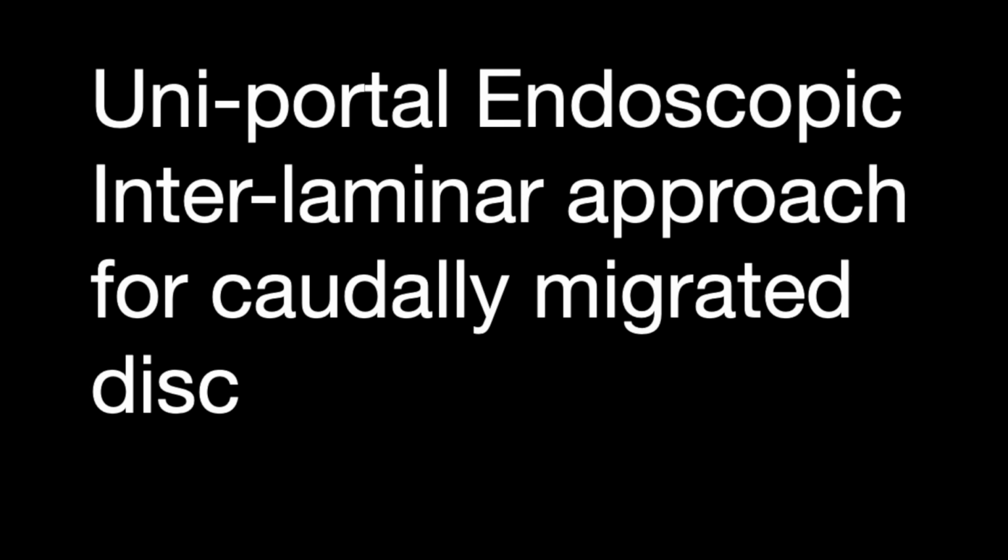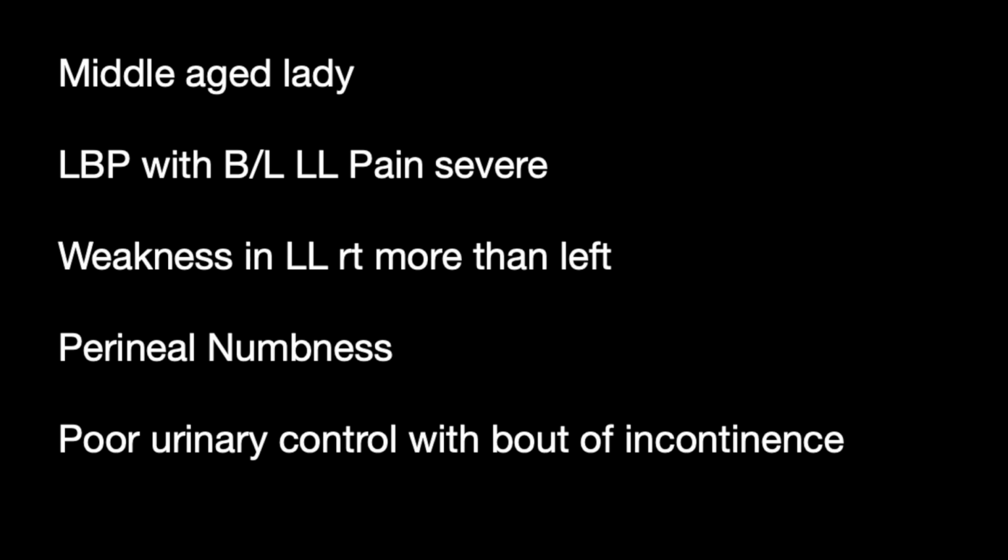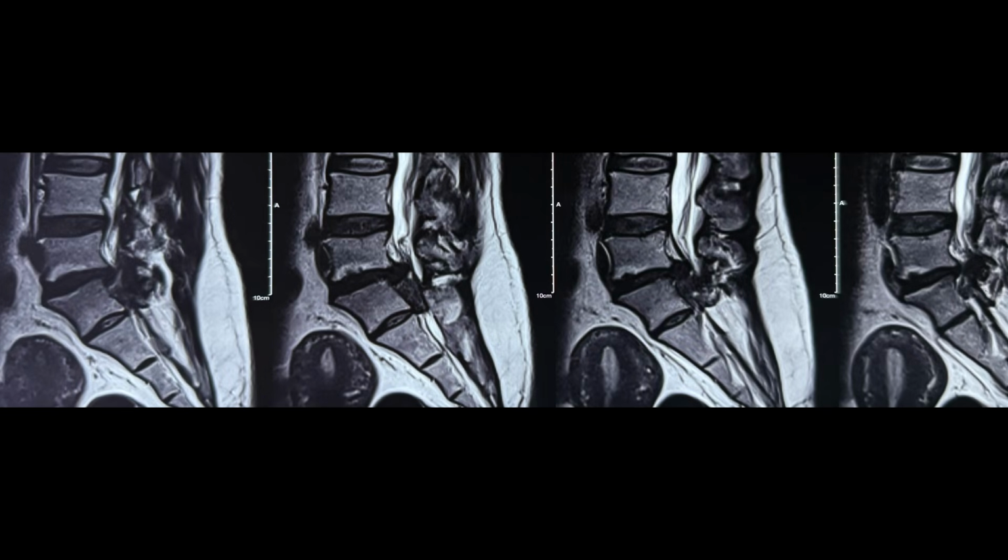Hello friends, this is a video demonstration of uniportal endoscopic interlaminar approach for caudally migrated disc herniation. The patient is a middle-aged lady presenting with low back pain with severe bilateral lower limb pain, weakness in both the lower limbs with perineal numbness and poor urinary control.